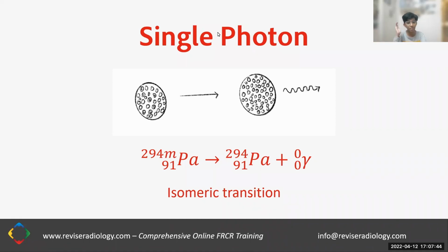What you have is a radionuclide, that is a nucleus which is exhibiting radioactivity, and it's in what is known as a metastable state. A metastable state is essentially a transitional state in which the nucleus has certain extra energy, which it's able to lose in the form of gamma radiation.